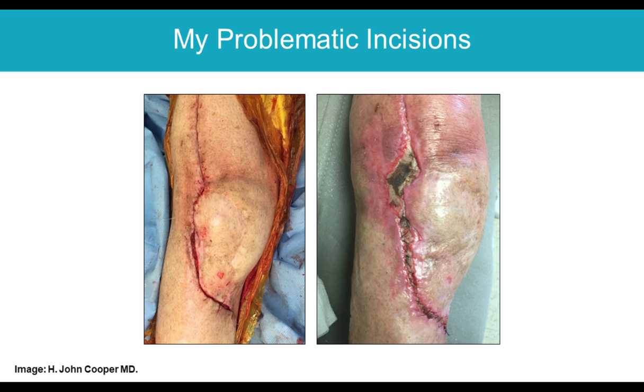I scrubbed out of the case just before my plastic surgeon colleague put in skin sutures, and this was under no tension. The case went very, very smoothly. All of his cultures from this case were negative, confirming that we were successful in resolving the infection. We covered this with 2 Aquacel dressings lined up end to end, kept him in the hospital for about a week. When we discharged him to a nursing home, there were no issues. We thought his incision was healing well, and we thought that we had finally, after years, gotten this patient to a successful outcome.